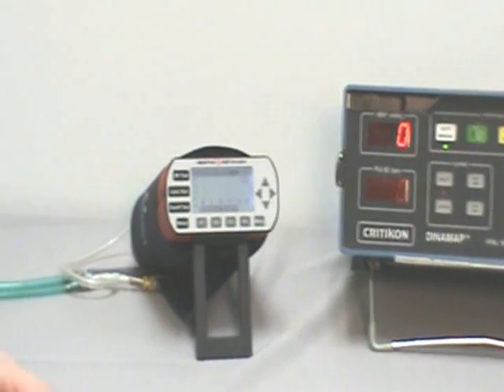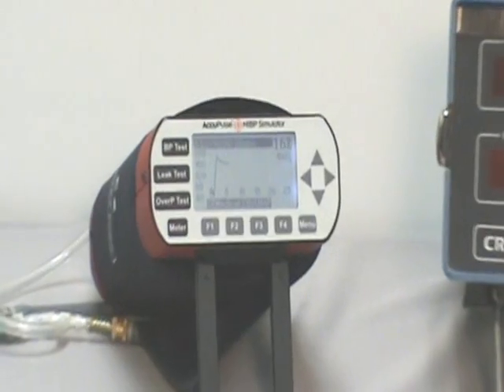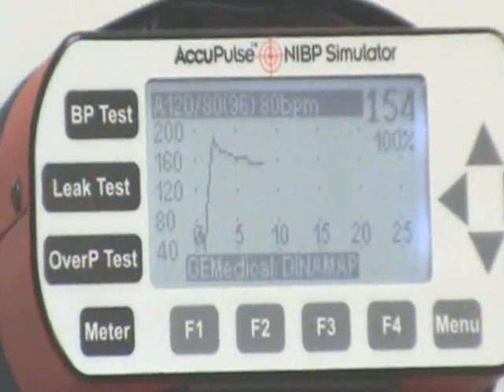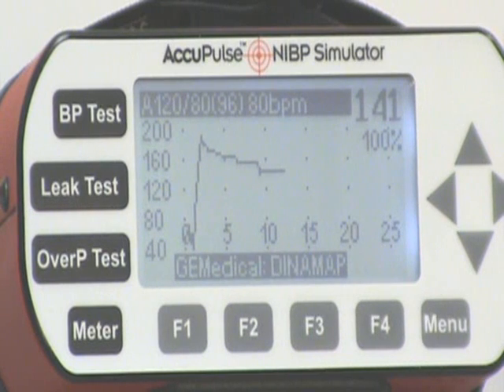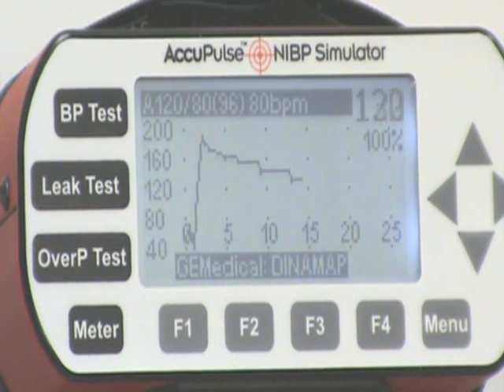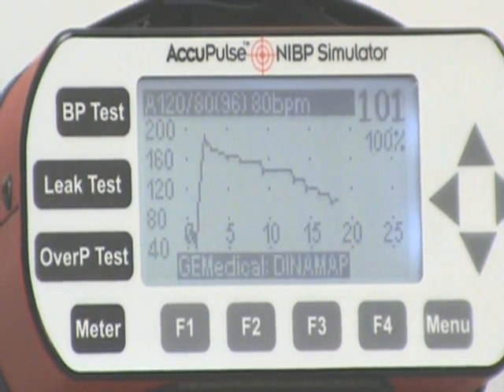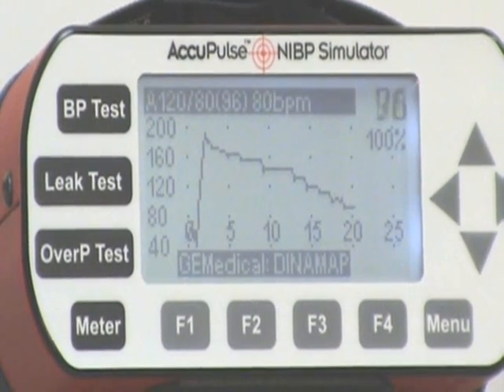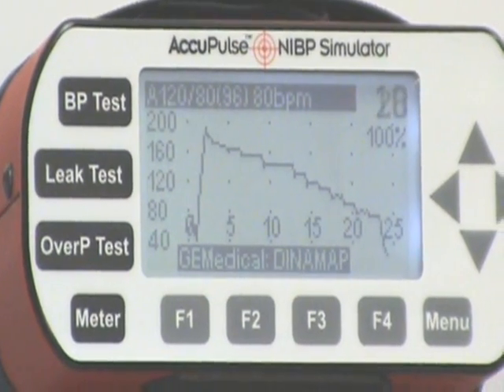As the cuff inflates, the pressure waveform is displayed on the screen. As the cuff pressure steps down, pulsations are generated by the Acupulse, similar to the beating heart, and accurate and reproducible blood pressure readings are obtained.